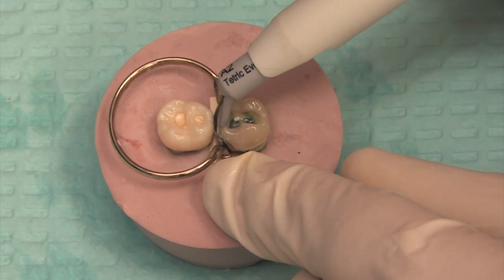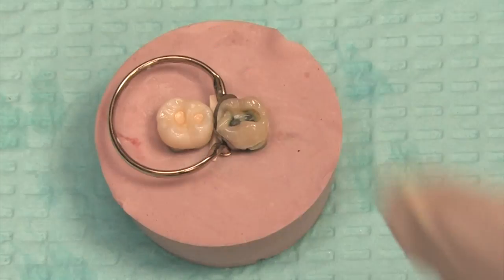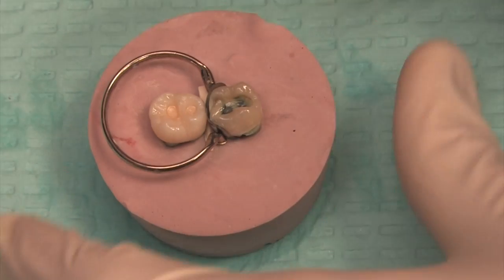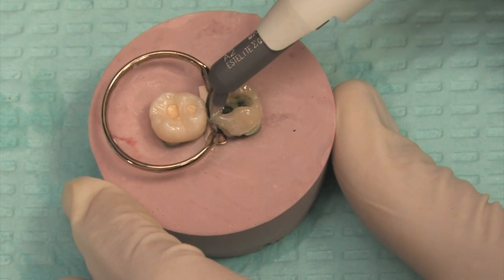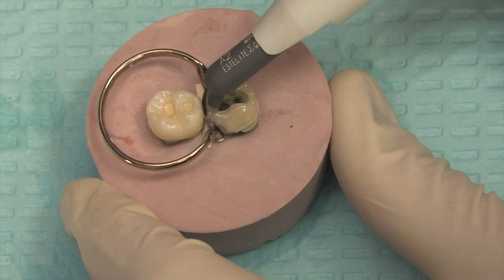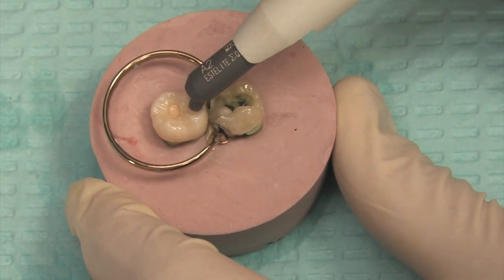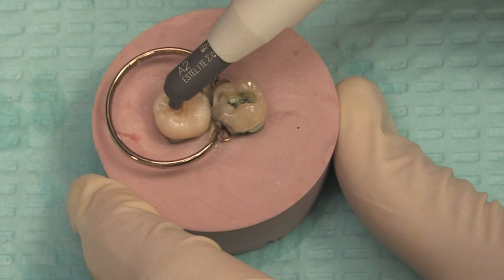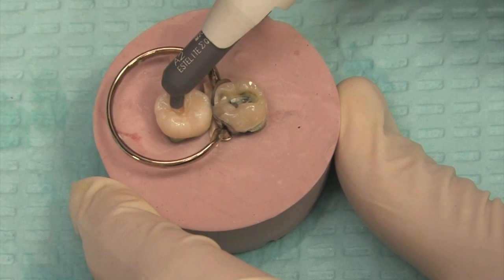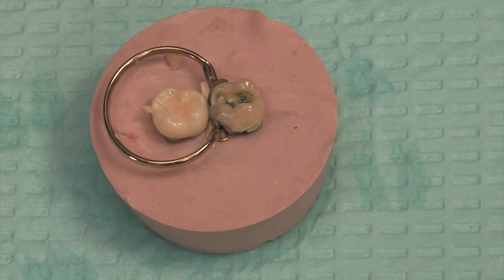Going in next with a little bit of flowable composite — just a dab. Then following next will be a regular hybrid composite, put right over the top of where that flowable is. Take a little bit off and make sure we have a fresh amount coming out. Squeeze it in there, peel it off, and go ahead and fill in the other ones, trying to do multiple surfaces in one increment to make it more efficient. Push it into position and smear it — it will stay in place.